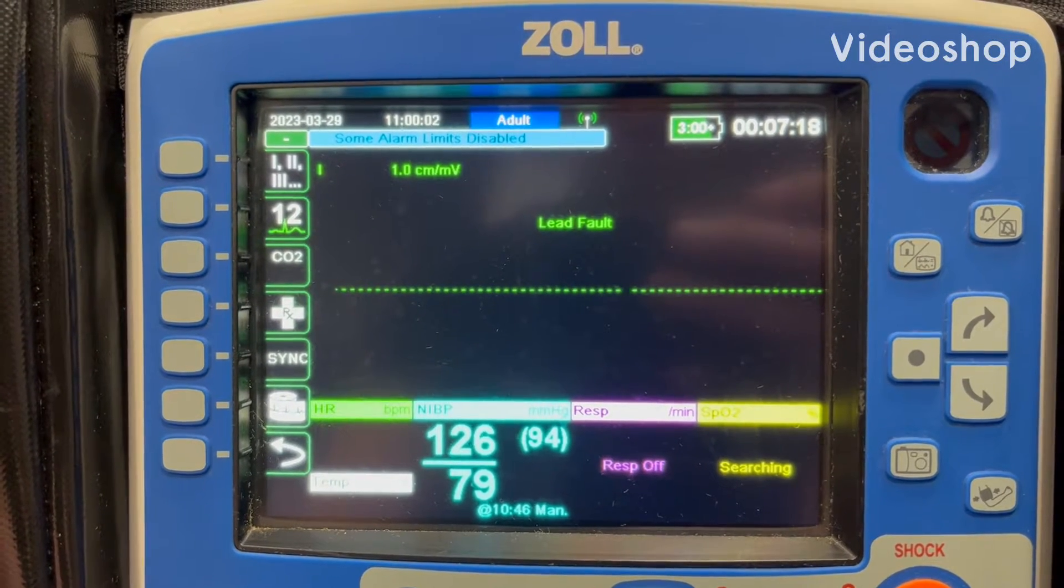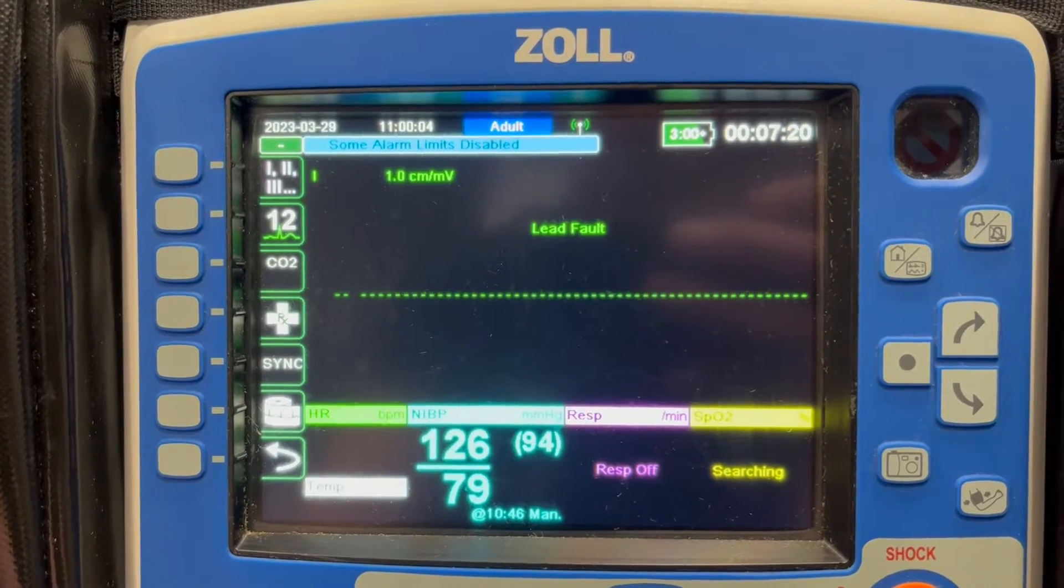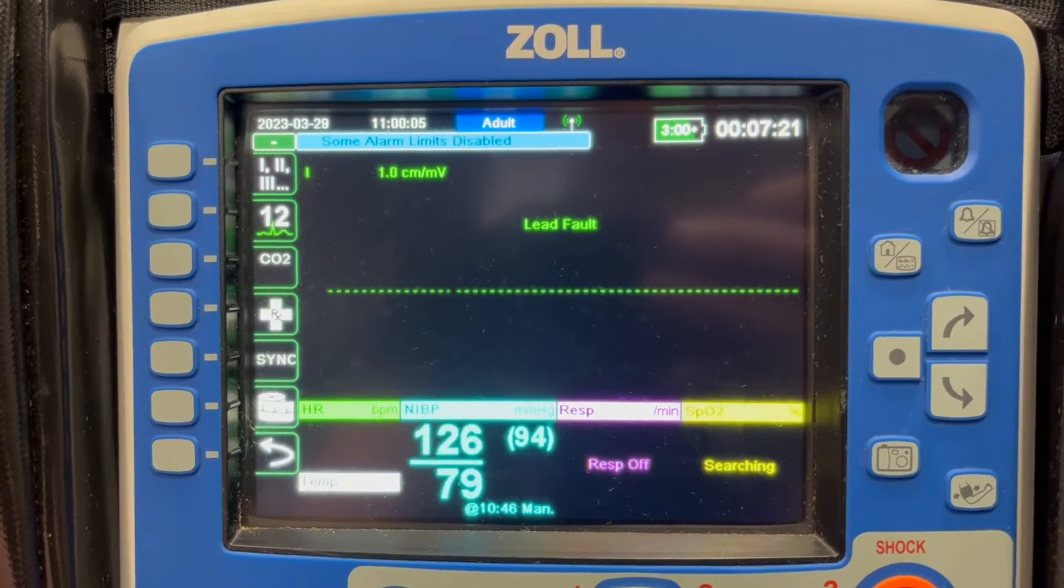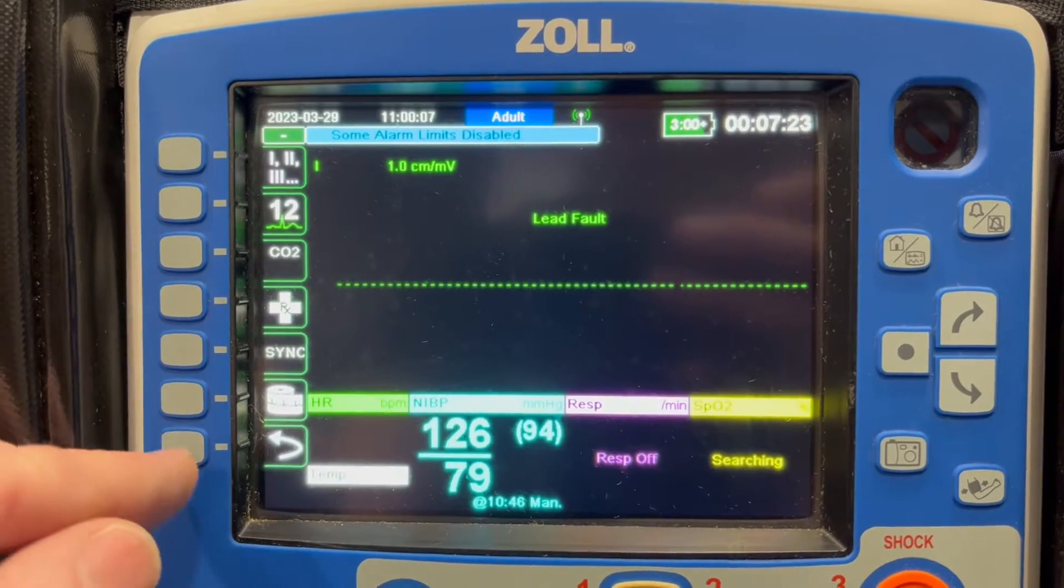Hi everybody, this is Kyle from ZOLL. I'm just going to quickly show you the upload steps from the X-Series to your EPCR if you have not done this before.